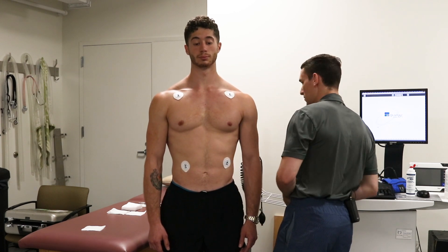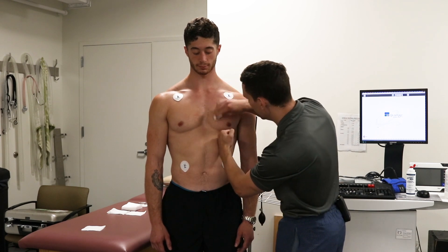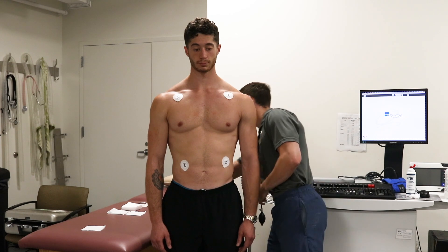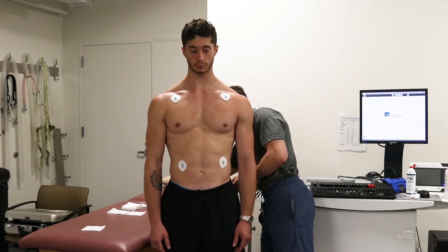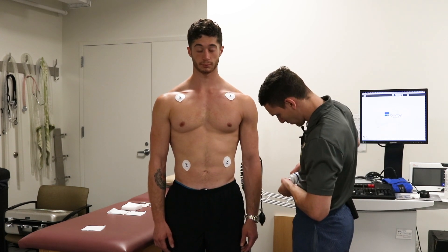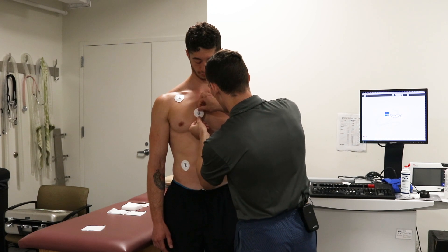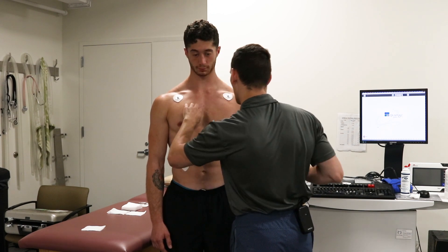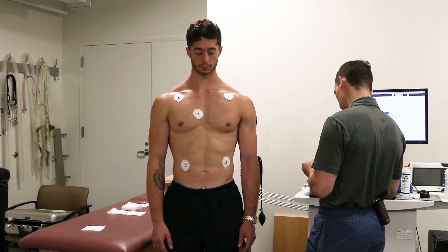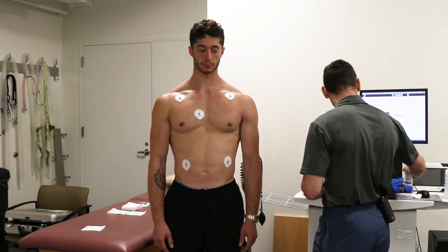We'll take our clean gauze to wipe off the alcohol, then place our electrodes. So we've got V1 on the right side and V2 on the left side.